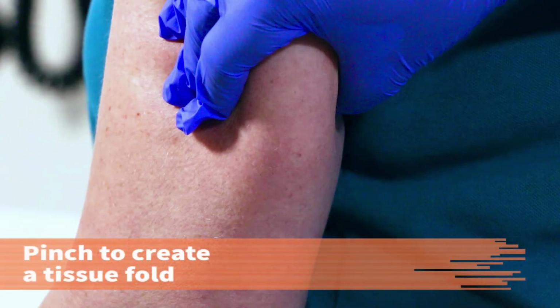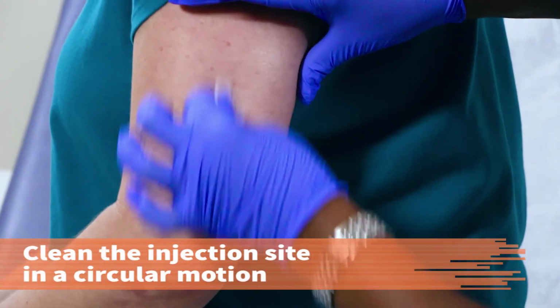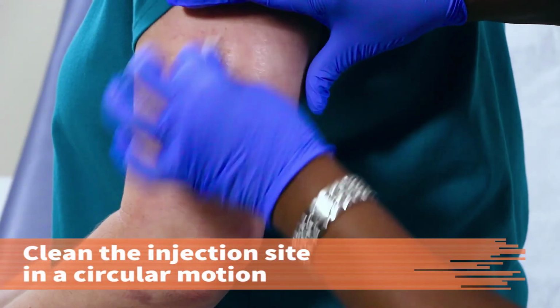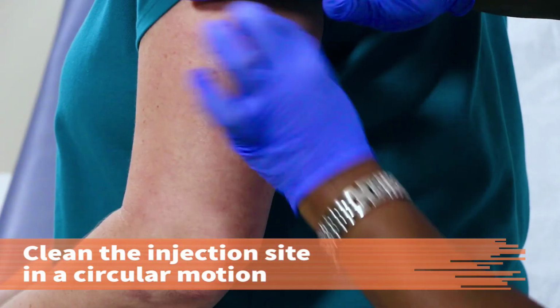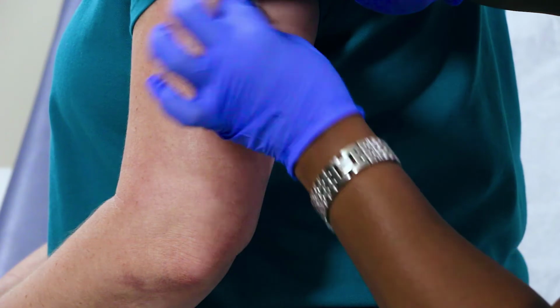With the thumb and fingers of your non-dominant hand, grasp the tissue of the patient's posterior upper arm, pinching up the area to create a tissue fold. Cleanse the patient's skin with the alcohol wipe, using a circular motion and moving outward from the center. Use some friction to help clean the site. Create about a 2-inch circle at the site.